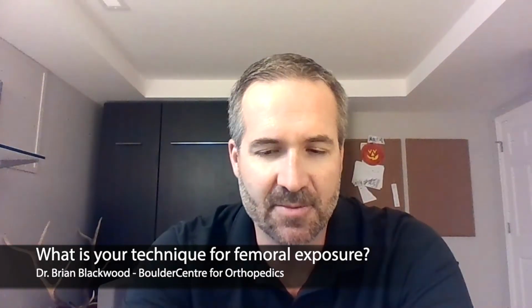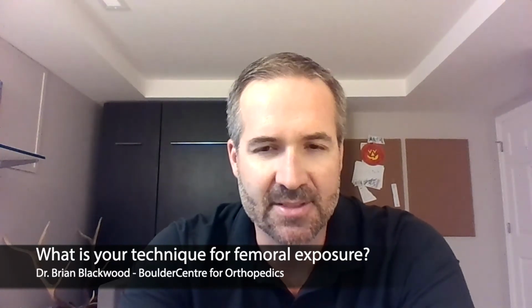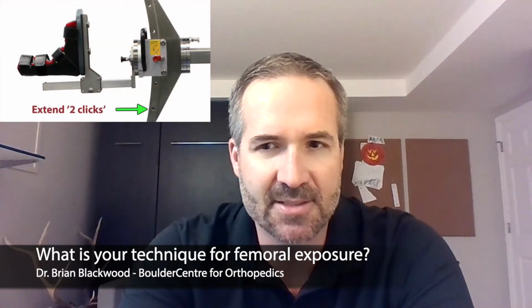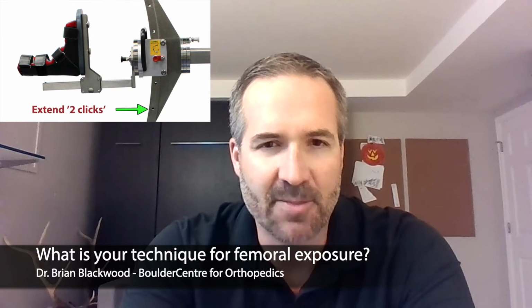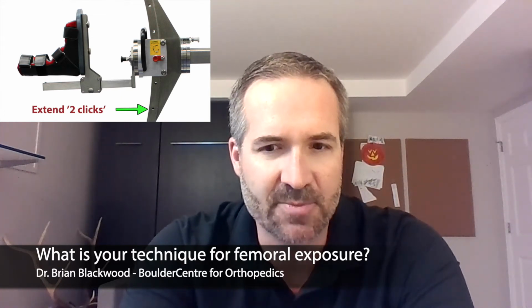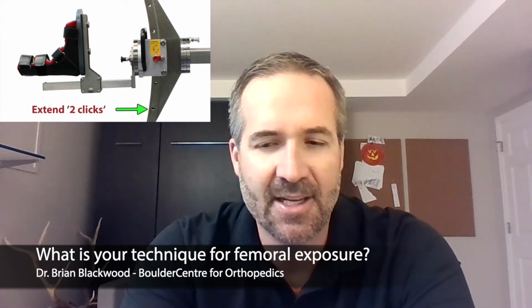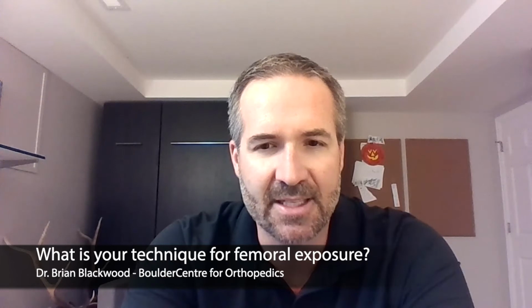So my technique and how I find that the arch table is helpful for that is we can start with our releases with the leg horizontal and then actually sort of meter the drop down. So we'll go down 2 clicks, see what tissue is under tension and needs to be released, drop another 2 clicks, figure out which soft tissue is holding us back, which area of the capsule needs to be released, and then drop it 2 more clicks before we go ahead and swing over into adduction.